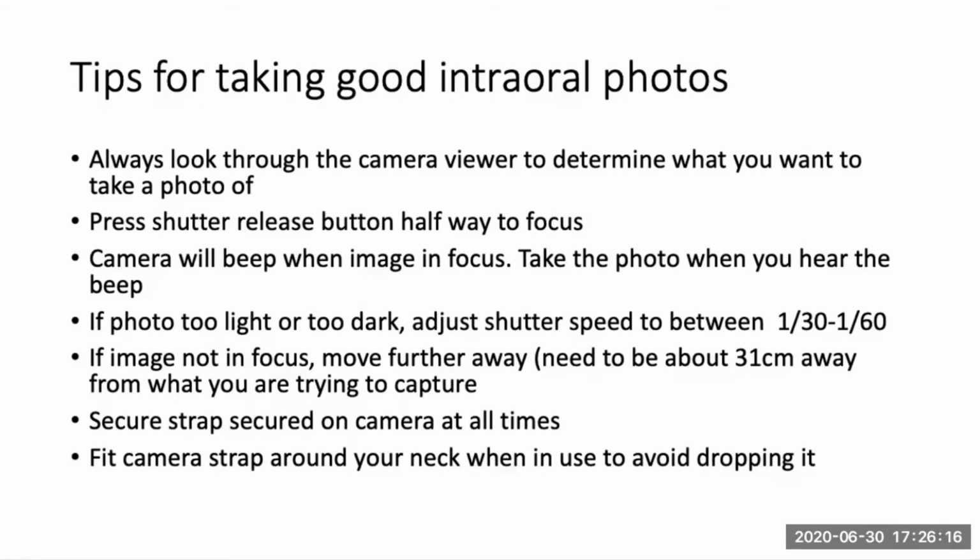So hopefully you've got the camera and you've got the images in your practice management software. A couple of tips here for taking good photographs. Look through the camera viewer to determine what you're going to take a photograph of. What you see is what you should get the photograph of. If you press that little shutter on the top right-hand side of the camera halfway, it should come into focus. The camera will try and find the focus. It'll beep, take the image as soon as you hear the beep.